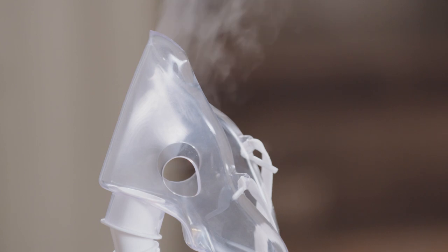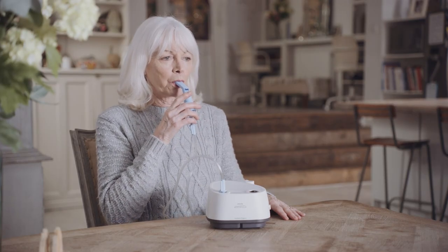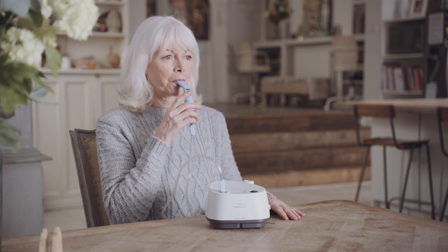If using a mask, place it securely in position over your nose and mouth and breathe slowly in and out through your mouth. Or, if using the mouthpiece, take it between your teeth, surround it with your lips and breathe in and out slowly through your mouth.